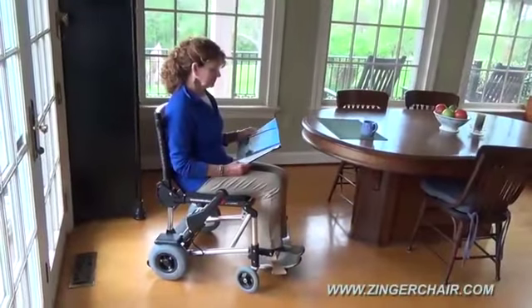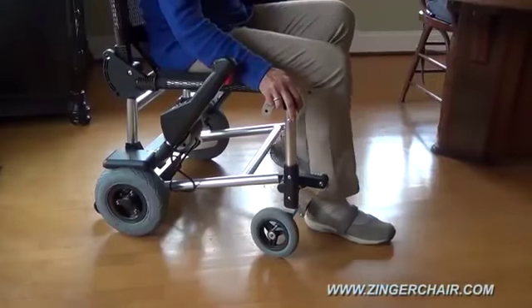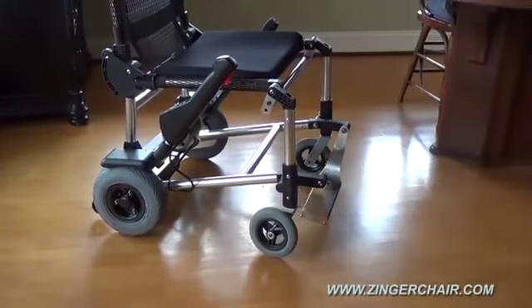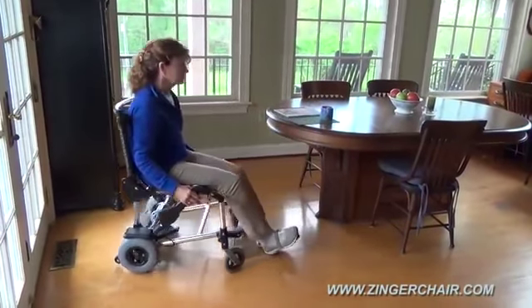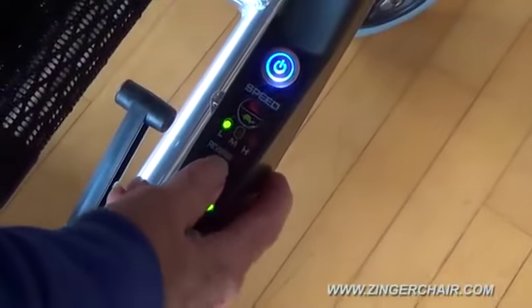Another Zinger original is its clever swing-away footplate. While most scooters have an elevated foot platform to step over, the swing-away footplate makes getting in and out of the Zinger as easy as getting up from a kitchen chair. And since there is no platform in the way, you can back your Zinger out simply by pushing off the floor like you would in a rolling office chair. Or if you'd rather, there's also a low-speed powered reverse.